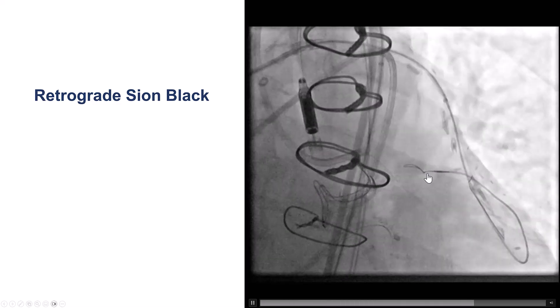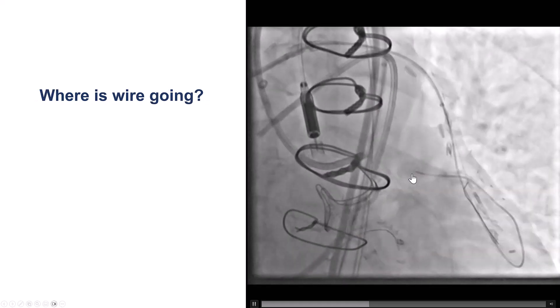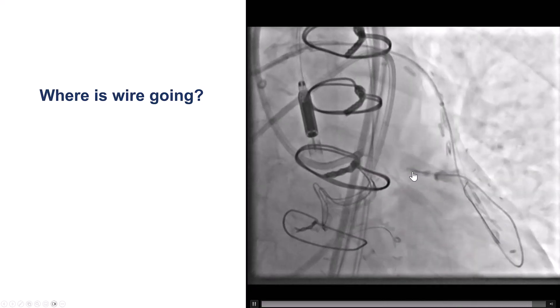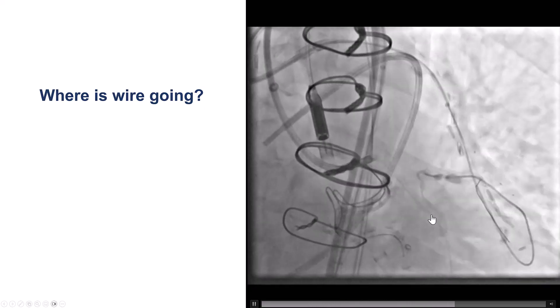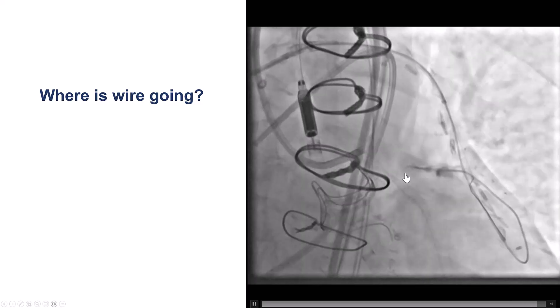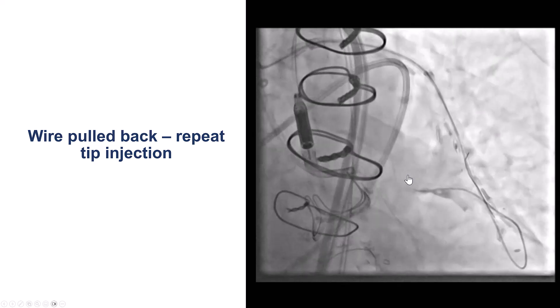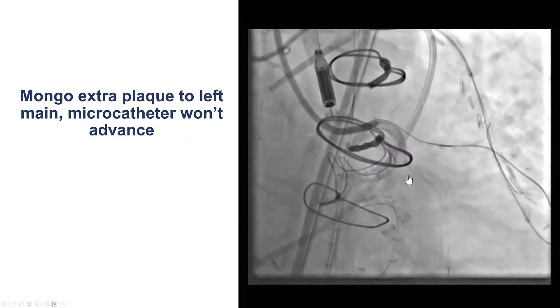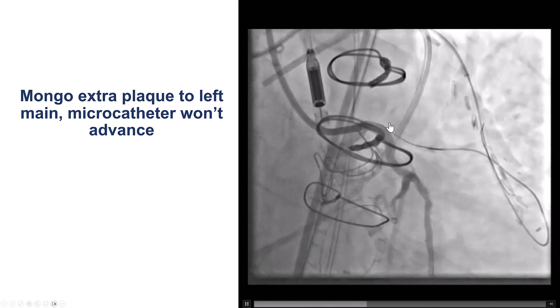We advanced a retrograde Sion Black wire to the proximal cap. The wire is knuckled and is taking a bend. We had this wire go into a bend on the top and then on the bottom. We then took another picture through the microcatheter and the wire seemed to have gone into a small side branch, potentially with some extravasation. So we pulled it back and did a repeat injection. Now it looks like we are into the architecture of the vessel. We then switched to a Gladius-Mongo guide wire that went extraplaque to the left main.